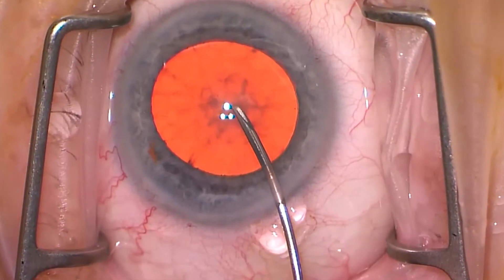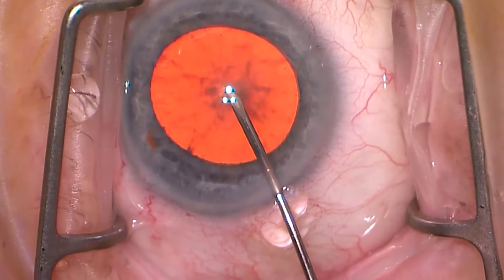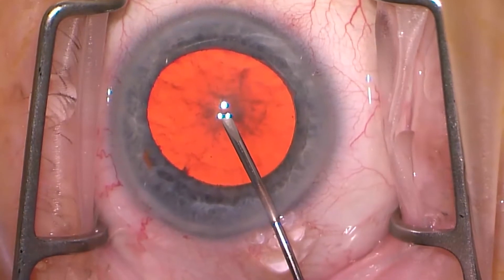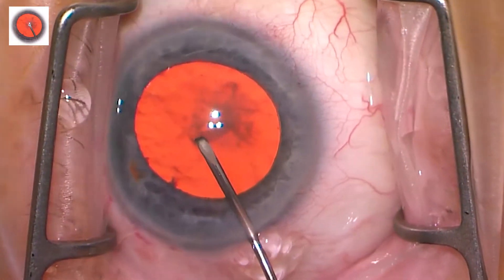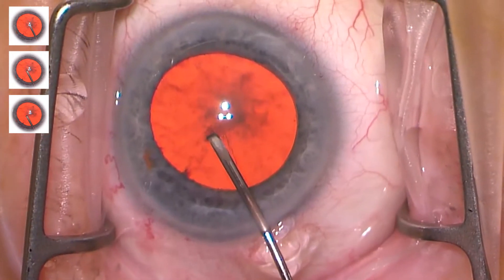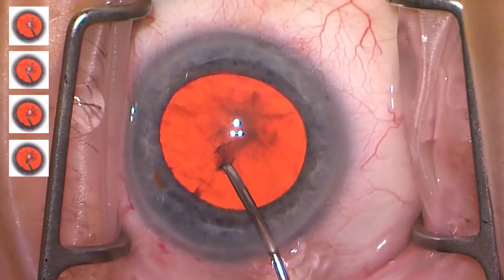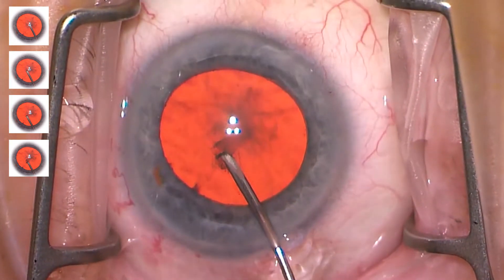This is the first of our critiques on initiation of the capsulorhexis. One of the things we're going to notice quite a lot in this first set is a very gentle approach. Remember, we're tearing an elastic membrane, and gentle is not necessarily the right approach. Forceful is, but it's got to be forceful and controlled.